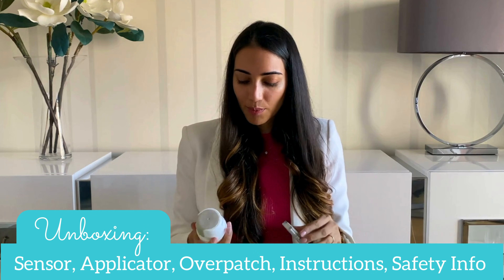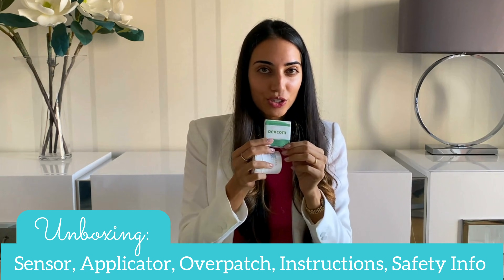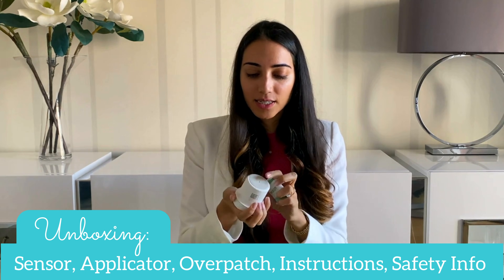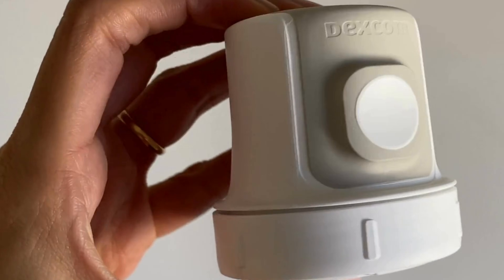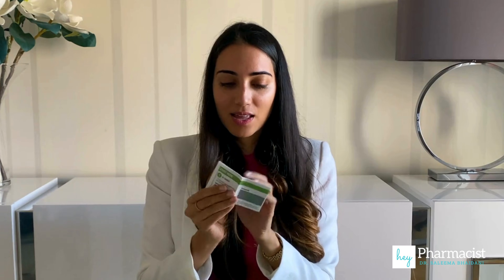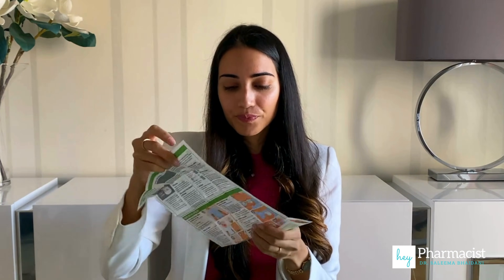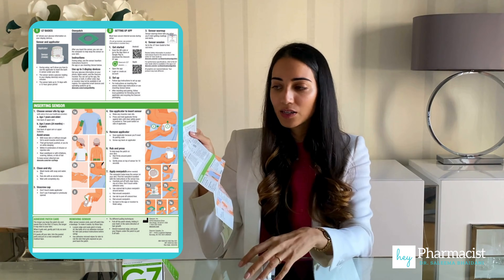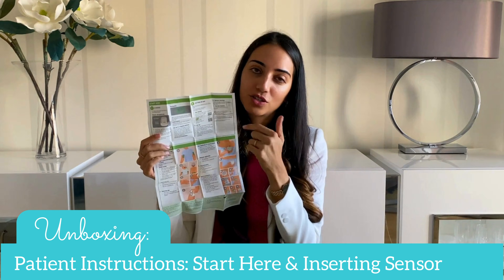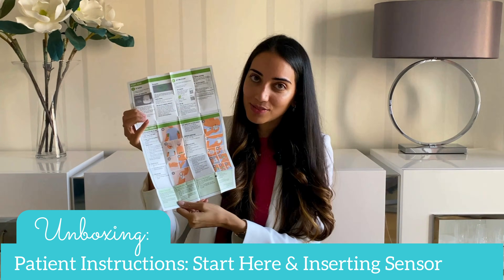All that came out of the box was this manual with an overpatch — I'll get to that — and the sensor inside of the applicator. I think the most useful item will be the start-here guide, which goes through the basics of what this is, instructions on setting up the app, and this part here is about inserting the sensor.